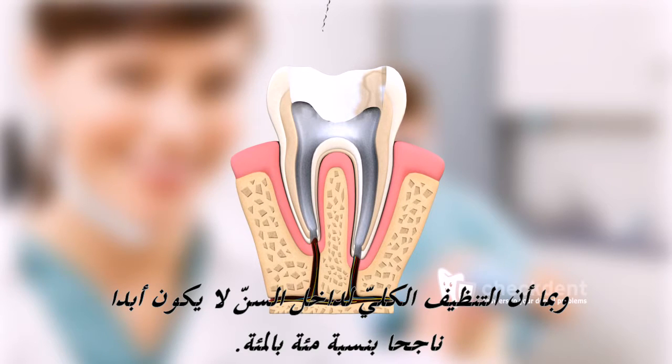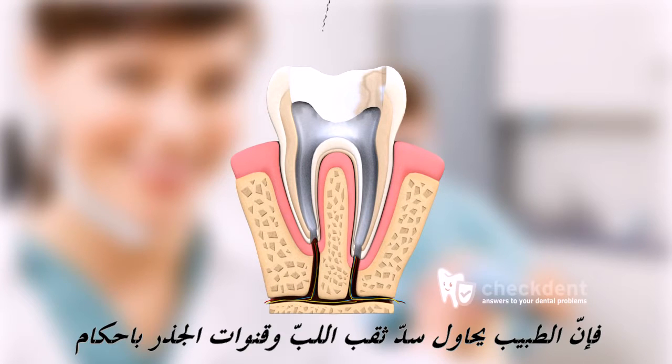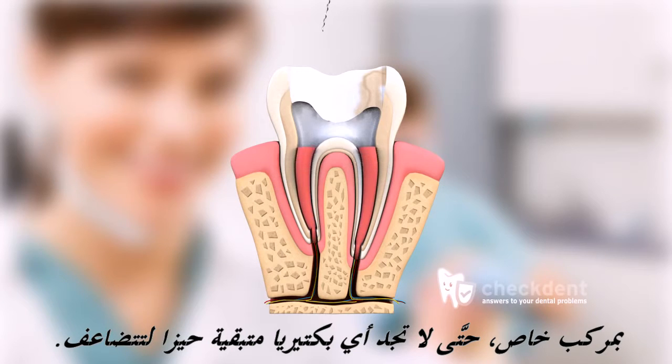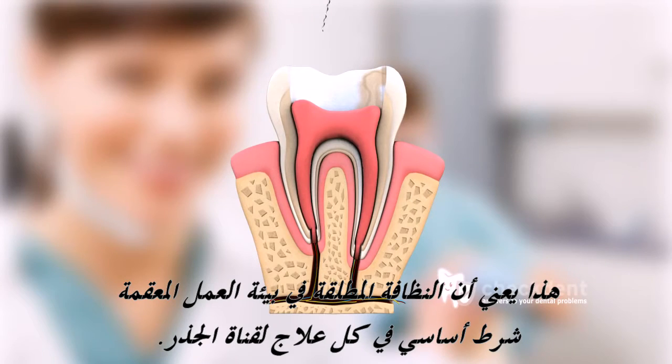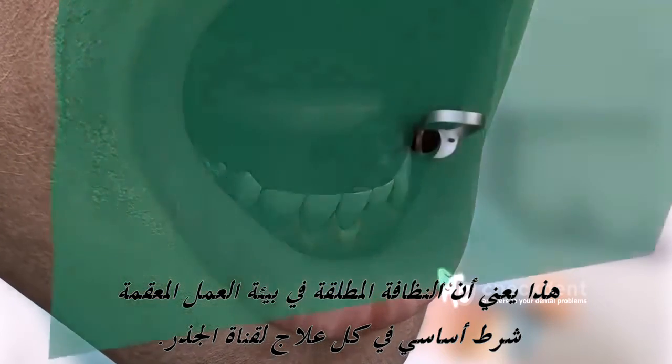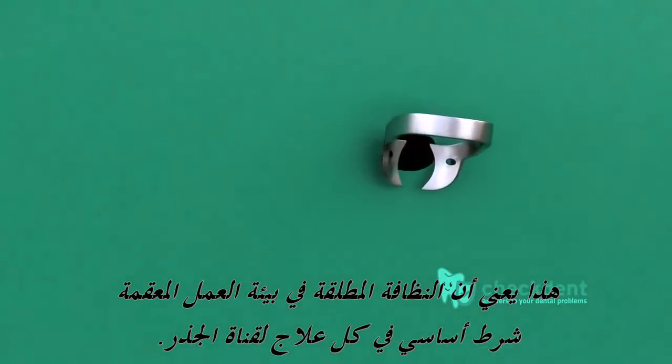Since complete cleaning of the interior of a tooth is never 100% successful, the dentist attempts to close the pulp cavity and the root canals tightly with a special compound so that any remaining bacteria don't have space to multiply. This means that absolute cleanliness and a sterile working environment are prerequisites for any root canal treatment.